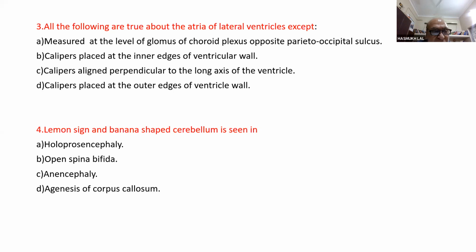And one more thing, Kypros was very firm, and he was a great critic of Americans, because they were not taking the lemon and banana as ultrasound markers in the beginning. They were still carrying on with the alpha fetoprotein. And he said they wasted 31 years to accept that ultrasound is the best marker to detect open spina bifida by looking at lemon and banana.